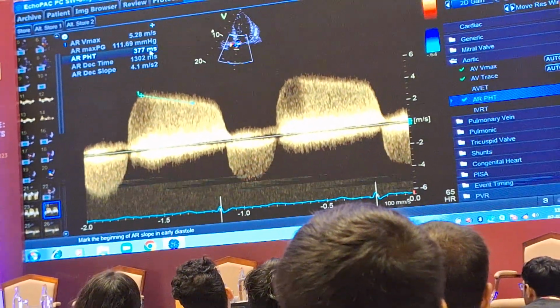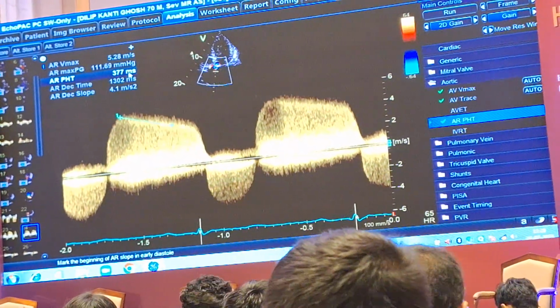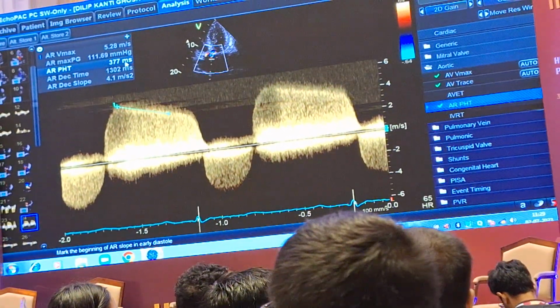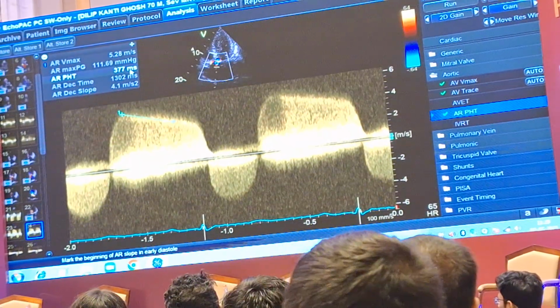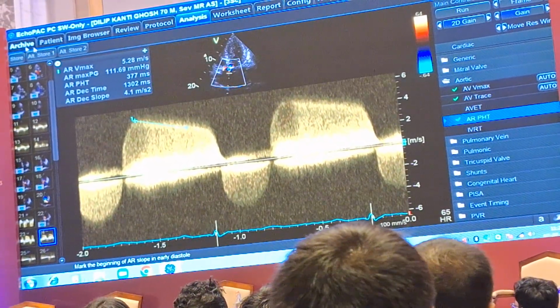How much time left? Or finished? Time left? 10 minutes. Or somebody is going to the hypertrophic cardiomyopathy, you are wanting. So that is one case of hypertrophic cardiomyopathy.